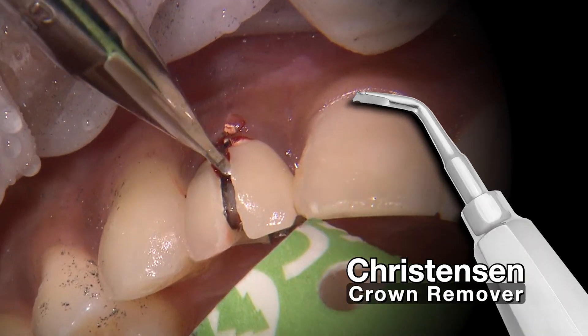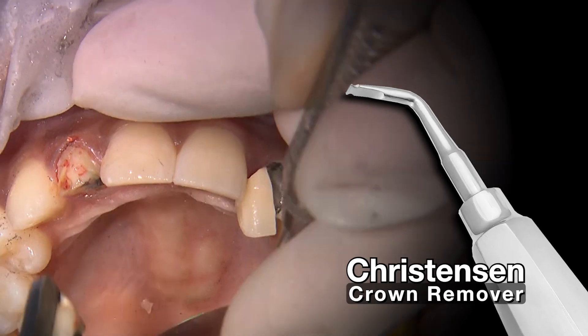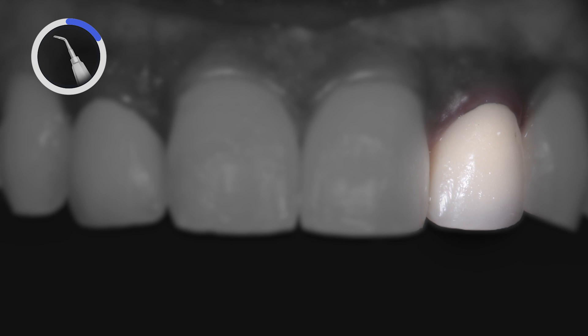Welcome back to part two, where I'll now take you through the prep and impression for the Bruxer Aesthetic Restorations that we placed on tooth numbers 7 and 10.